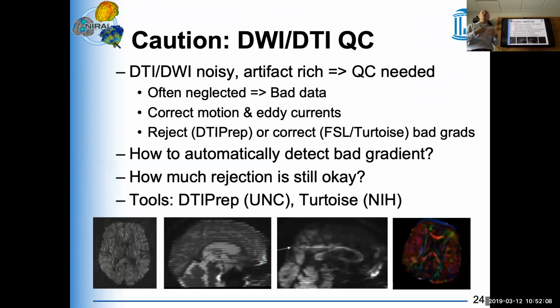But of course, if you reject half of your data, trying to correct it is maybe not the best thing either. I'm thinking of analogies with EEG. If you rejected it for one participant, would you need to reject it across all, or would you have no problem? No, I mean, that's where the SNR comes in. You can't reject too many of them, because otherwise the SNR settings across different subjects are going to be different. So that's why you want a limit on the amount of rejection.